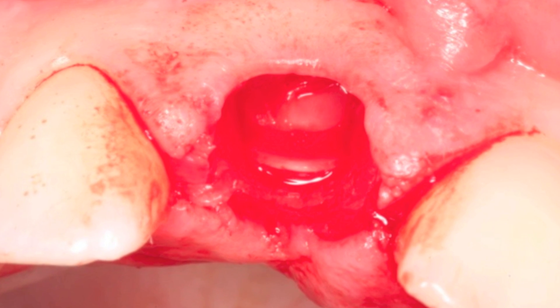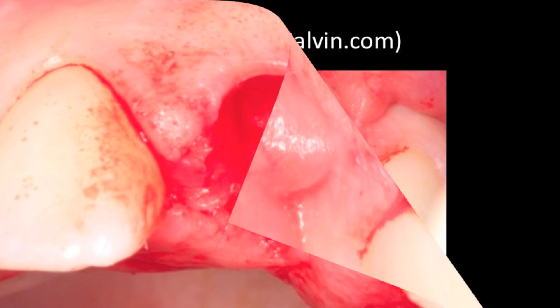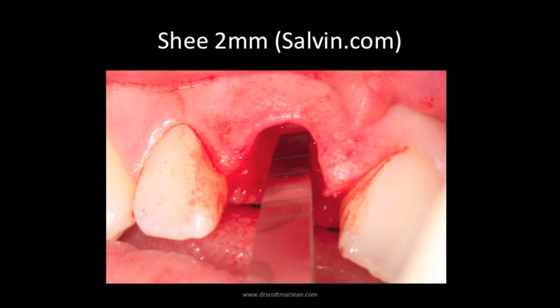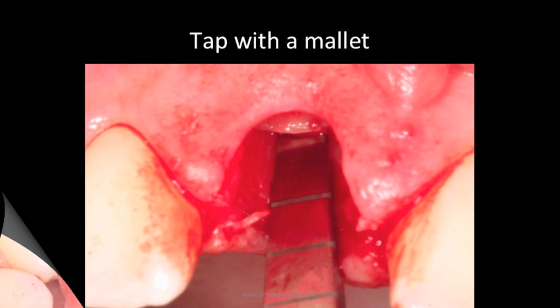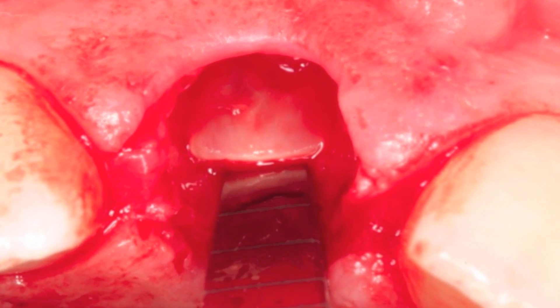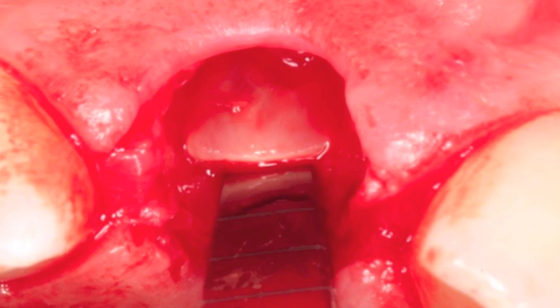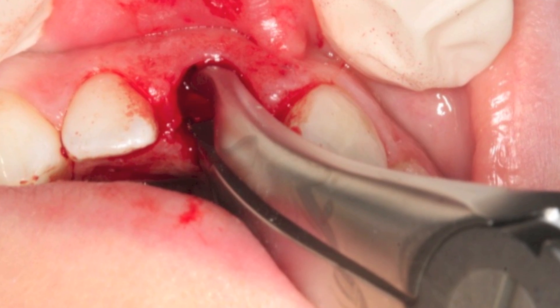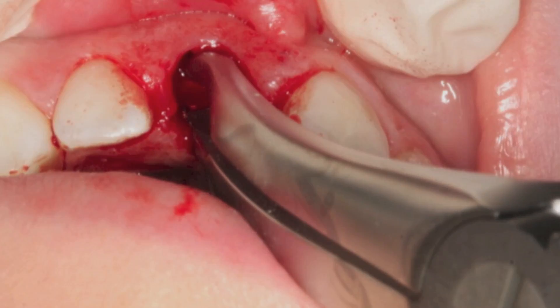What I like to do in these cases is to stay away from the buccal plate. So I'll use a Shea 2-millimeter tool from Salvin.com, get behind the tooth because I'm going to be removing a little bit of bone in that area anyway, and then I'm able to get the tooth out fairly easily. You kind of laterally displace it and then get that tip out.